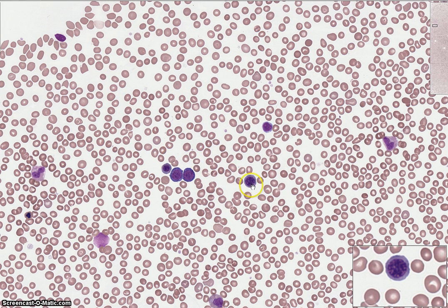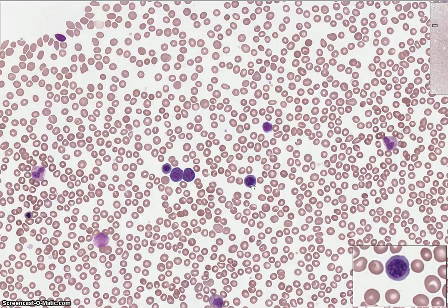There are two polychromatophilic normoblasts on both sides of these basophilic normoblasts. The cell size is progressively getting smaller, though you'll notice there can be a range in sizes. There's further clumping of the nuclear chromatin and it's still uniform throughout the cell. The cytoplasm color has transitioned to more of a purple-gray color due to the cell making and accumulating more hemoglobin.